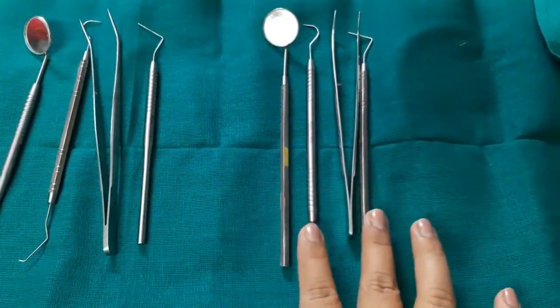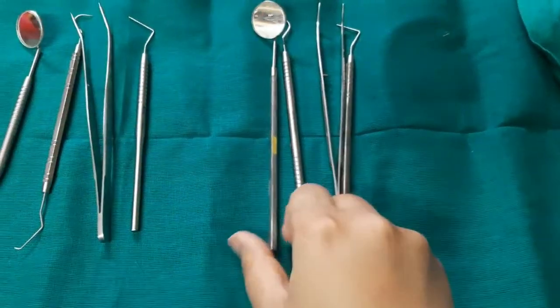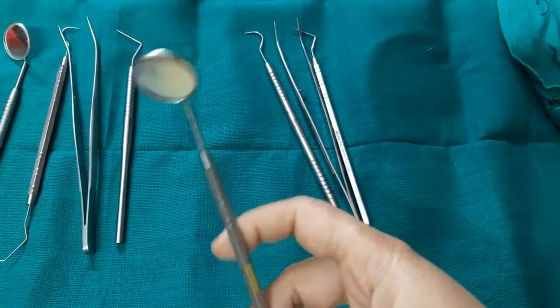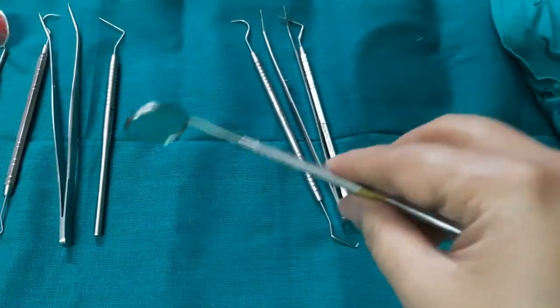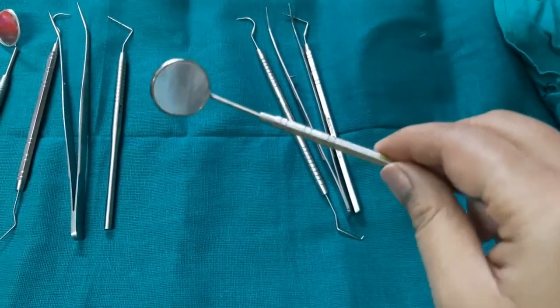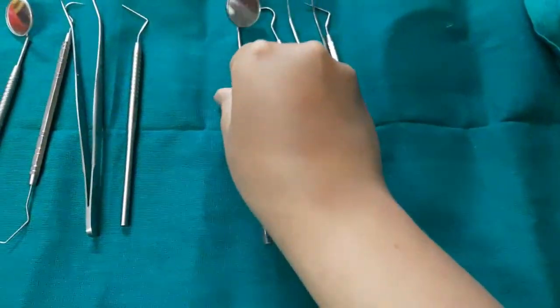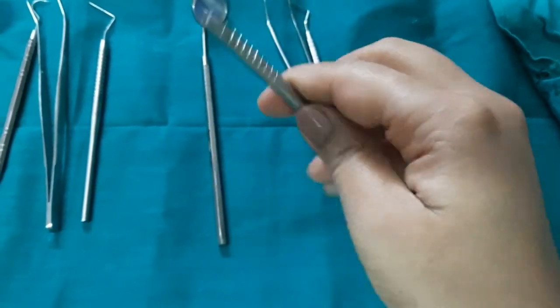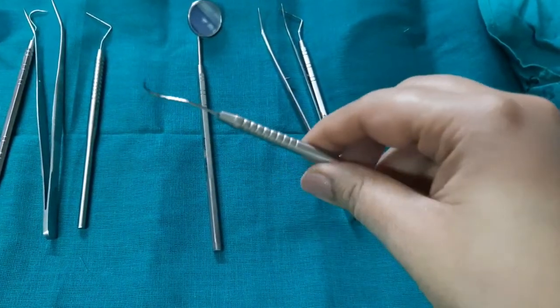Here I have two diagnostic instrument sets — one for the teacher and one for me who will be showing the work to the teacher. In the diagnostic instrument set we have the mirror. Without a mirror you are nothing as a dentist. The mirror is used for direct vision, indirect vision, illumination, retracting the cheeks, and also for retraction. Next we have the explorer and the Shepherd's hook, which is used to detect caries and also to detect the calculus present in the margins of the tooth.